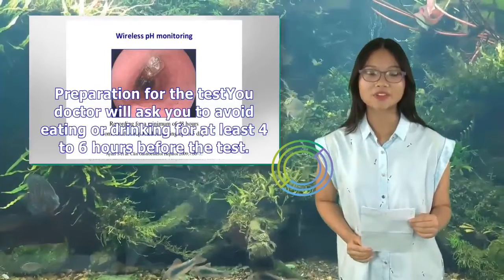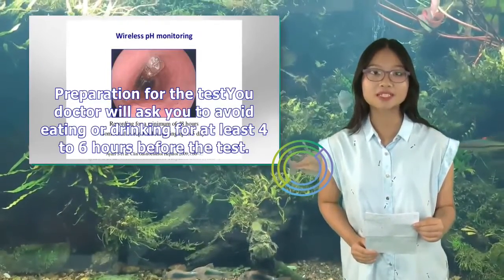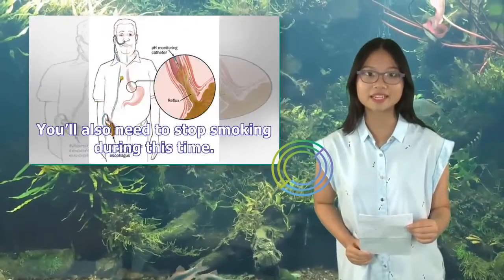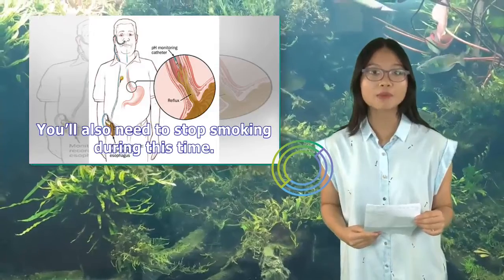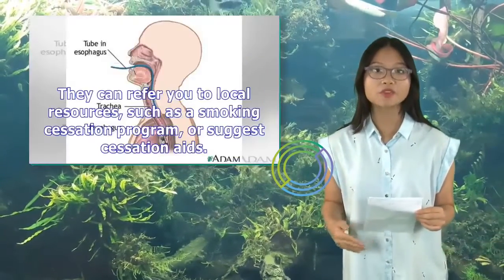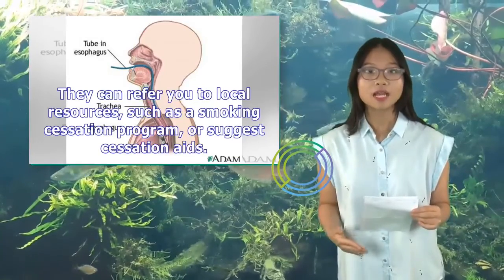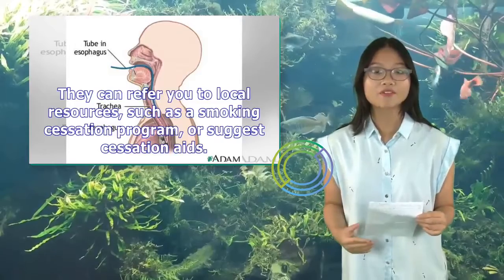Preparation for the test: your doctor will ask you to avoid eating or drinking for at least 4 to 6 hours before the test. You'll also need to stop smoking during this time. Be sure to speak with your doctor if you need help quitting. They can refer you to local resources, such as a smoking cessation program, or suggest cessation aids.